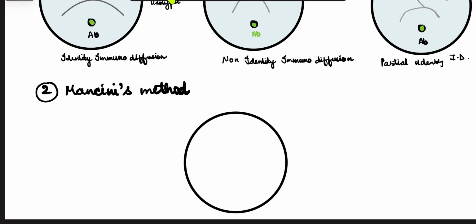But in this plate we are doing one difference. The agar which we were adding now also contains the particular antibody, meaning we are adding a mixture of antibody and agar. Let's say because of the addition of antibody, the color of the agar changed to this. So what I refer to here is that the antibody is uniformly spread in the whole plate.